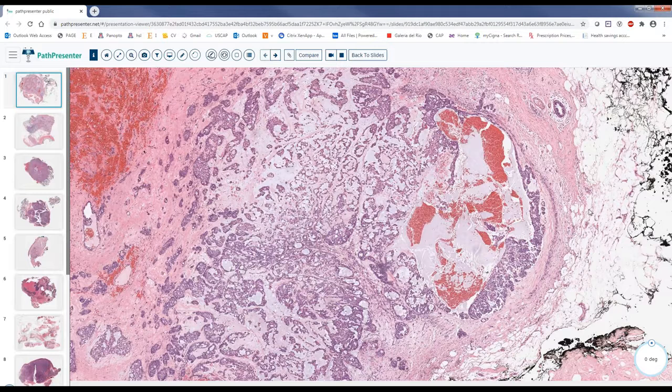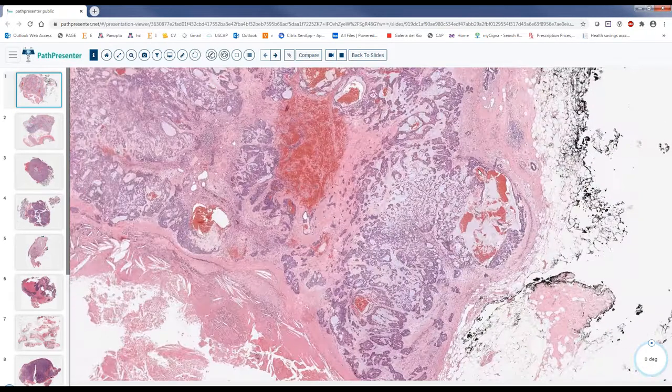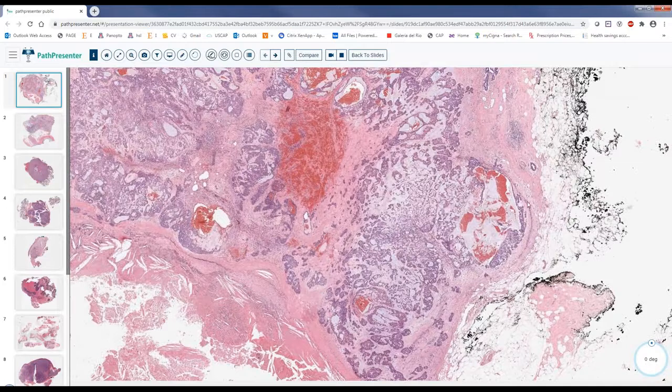As we know, our histopathology is two-dimensional, and the reality is lesions are three-dimensional. So if somebody has a superficial cut, we miss this area, and sometimes it will go through the ink and the margin will be positive. And the problem is, what is the significance? The significance is there is a tendency for this pseudopodia to have recurrence.